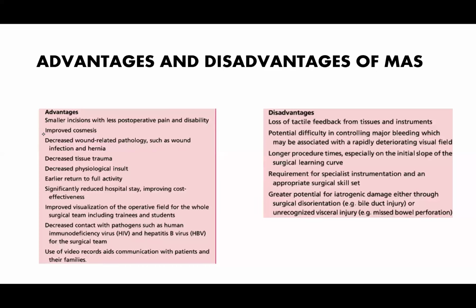They significantly reduce hospital stay, improving cost effectiveness, improved visualization of the operative field for the whole surgical team, including trainees and students.